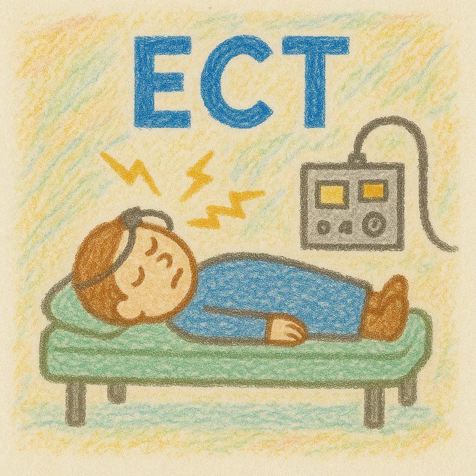Other than those kinds of really severe cases where you're just trying to get someone better as soon as possible, the other 2 options would be basically a formula-based dosing. So there are different formulas you might plug in the person's age and their gender, and there's some other demographics that you might plug in, and the formula spits out the predicted dose for that person, the optimal dose. And again, that's going to somewhat depend on the device manufacturer. The more standard of care approach these days, I think, would be a dose titration or seizure thresholding.